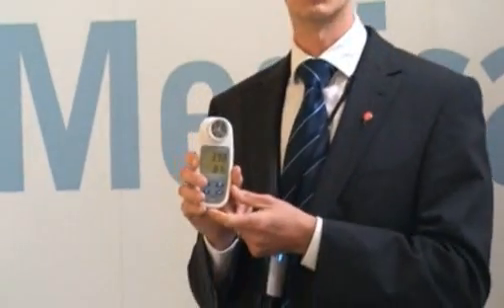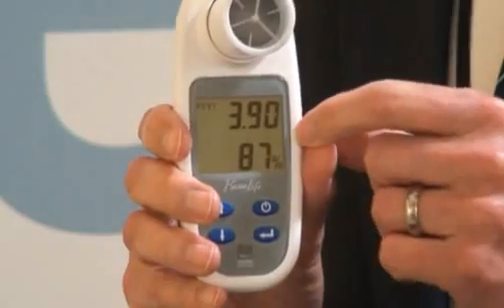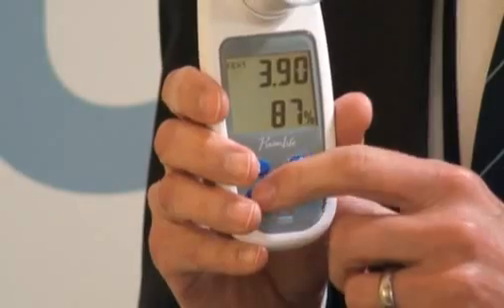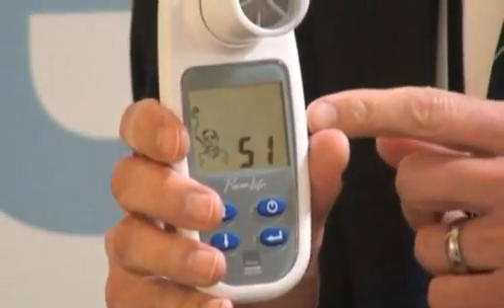It has straight away recorded FEV1 at 3.9, and it's come up with my percentage of predicted as well. So it's automatically looked up the predicted values and worked that out. If I just press the down arrow, it will give me my estimated lung age for the details blown into it.